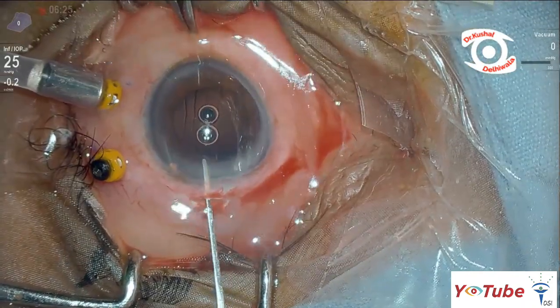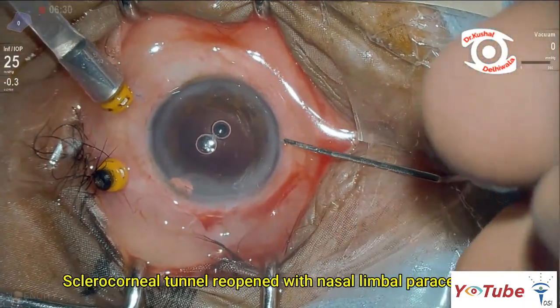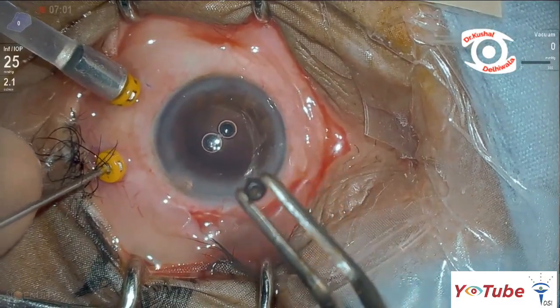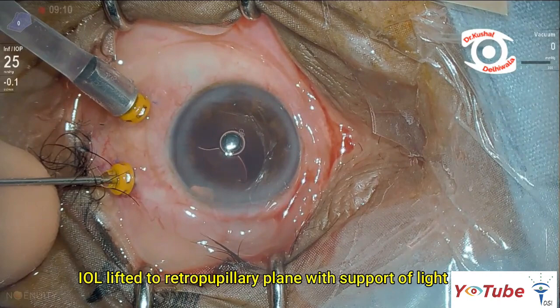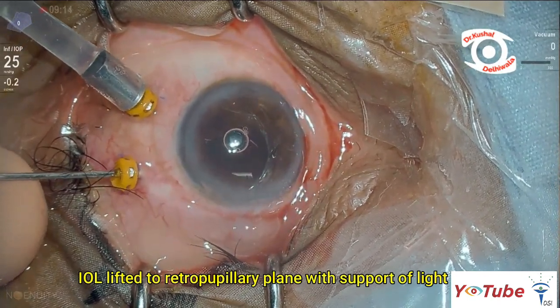The sclerocorneal tunnel from the first surgery was reopened. Using a light pipe through the supratemporal 23-gauge sclerotomy, the hanging IOL was supported, lifted from the vitreous cavity, and brought to the retropupillary plane.